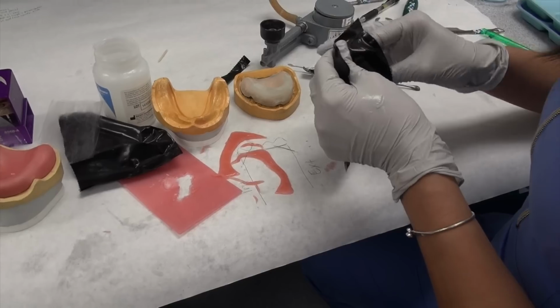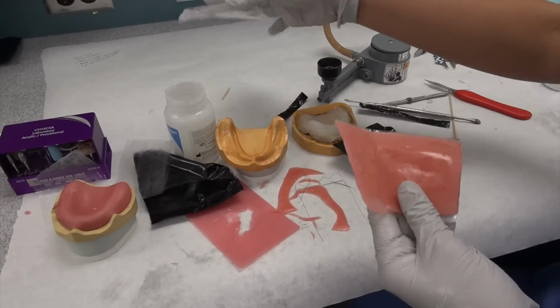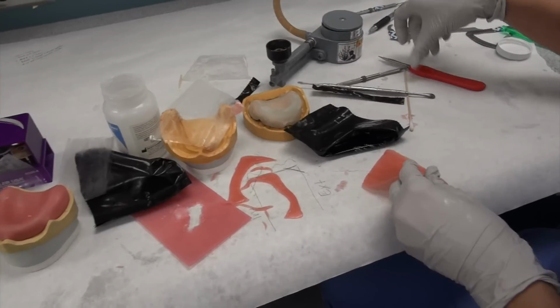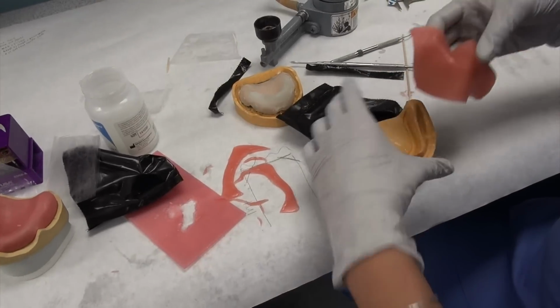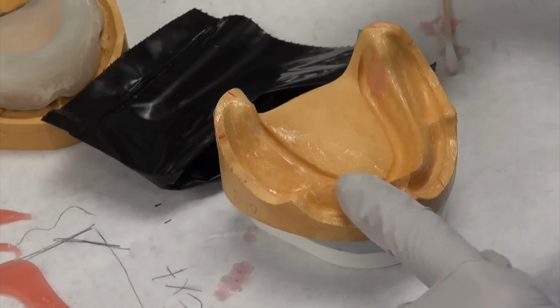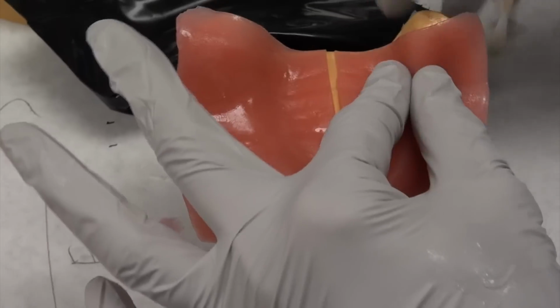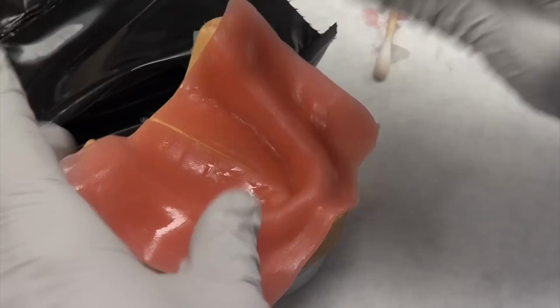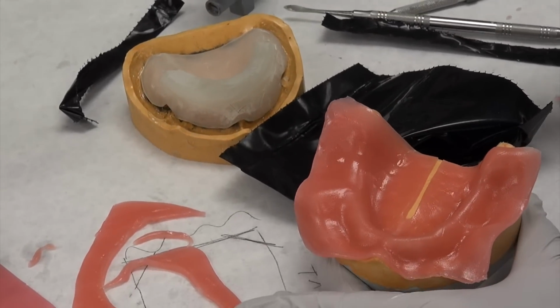Now the mandibular is going to be done exactly as we have just completed and exactly as you did on the custom impression tray. So you'll start to see how those skills that you learned and mastered in the previous weeks translate so perfectly here. Now again, make sure you have plenty of MRA, and that the MRA has had the 2-minute time to soak in, so that you don't have any fractures. Now this cast, you'll be using it for the next 3 labs consisting of record bases, which we're doing here, occlusion rims, which is adding a wax rim to it, as well as the teeth setup.